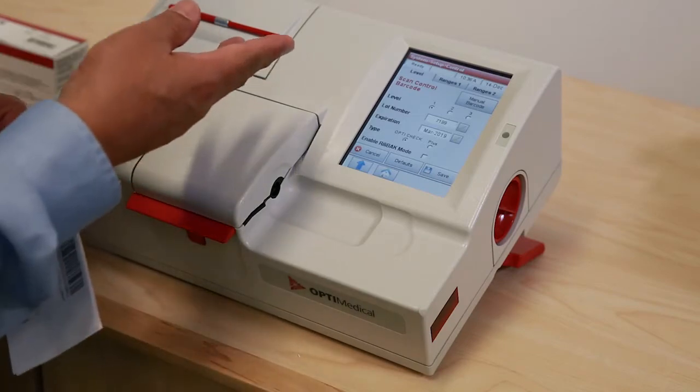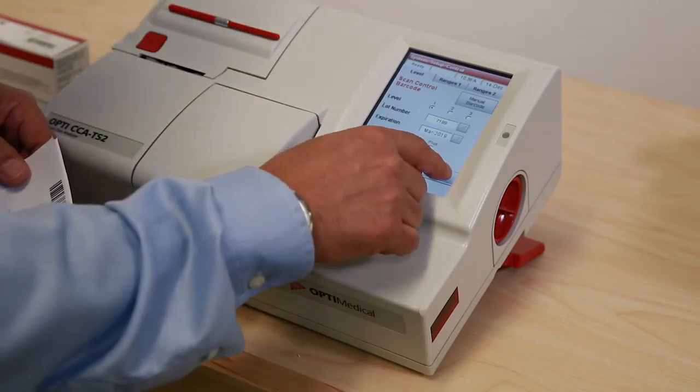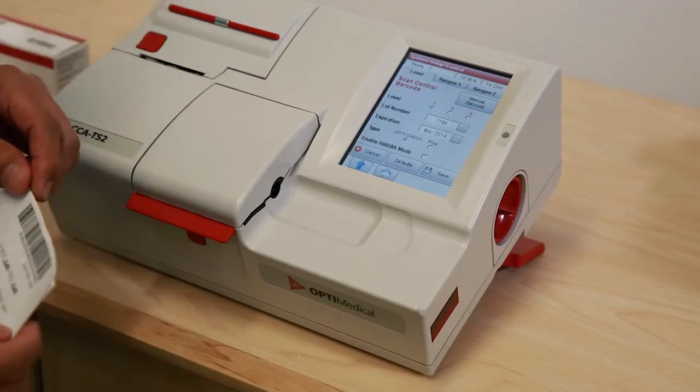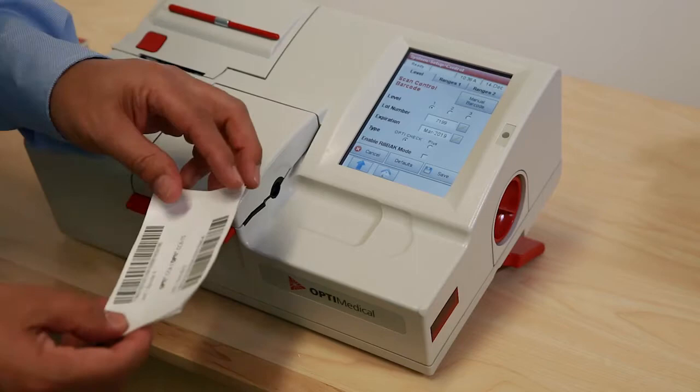The instrument prompts the user to press save. That lot is programmed into the analyzer. Then scan the next barcode.